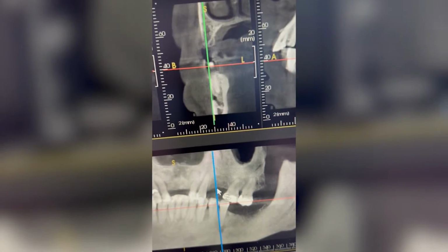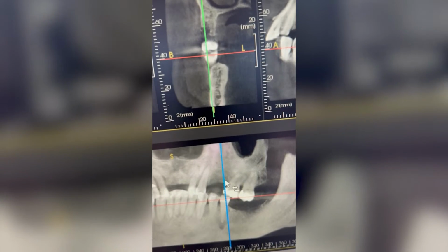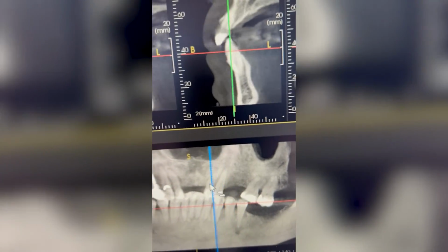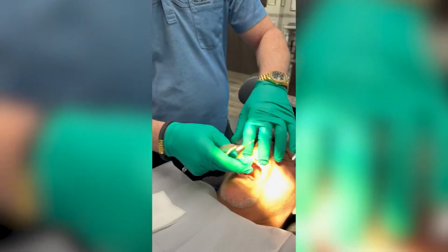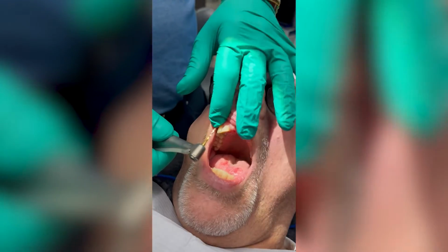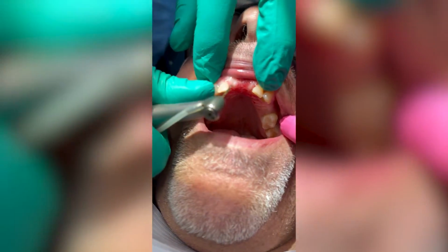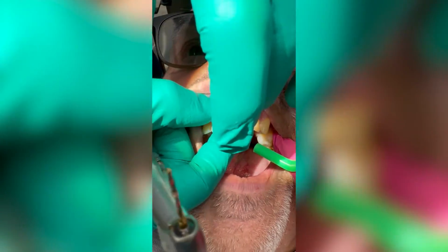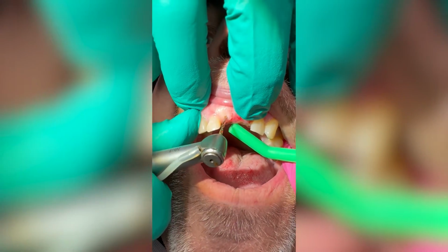And that's 8 and 9, here's 12 and 13. This was a more recent extraction, but I believe we have enough healed bone to place the implants today. Okay, so I'm Dr. Todd Shatkin. We're going to be replacing teeth number 8, 9, and 12 and 13, as I mentioned. And we're going to use our 1.5 millimeter pilot drill. And we have to make sure that we keep the implants between the buccal and lingual plate of bone.